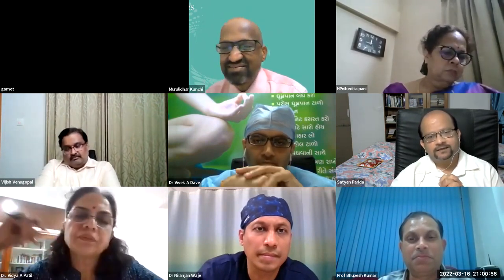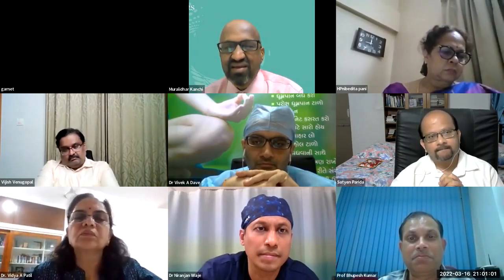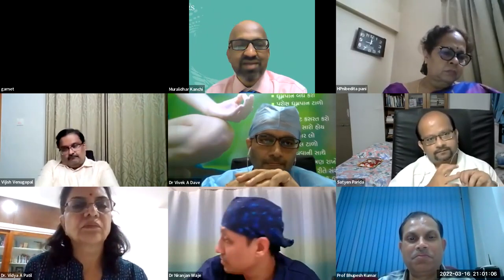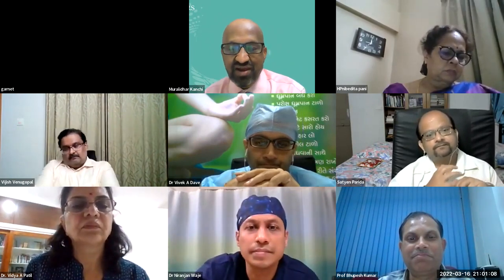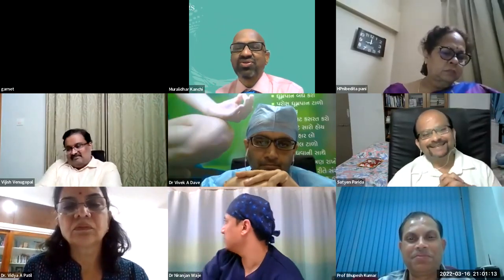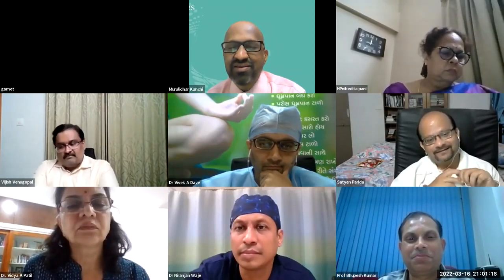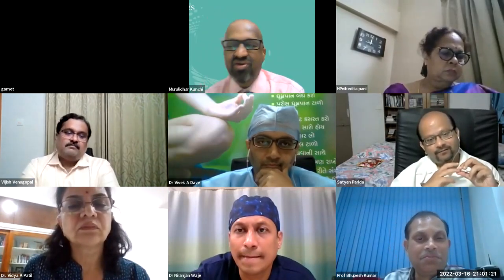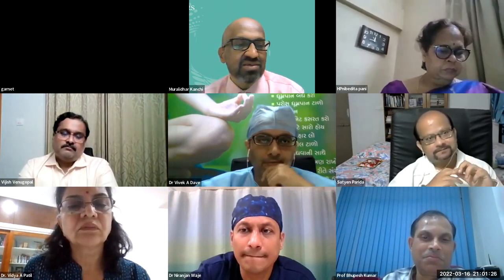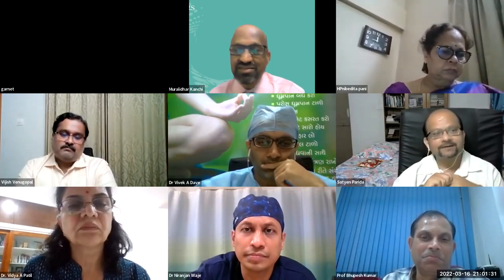But I think Dr. Thomas Serin has done a lot of work on it. He seems to believe it's quite useful. I have used it in heart surgery, but the machine cannot predict when the surgeon is going to lift the heart. So in cardiac surgery, it's virtually useless. The hypotension prediction crosses the 85 threshold, it goes beyond 85 when the heart is lifted. That is after the event has occurred.